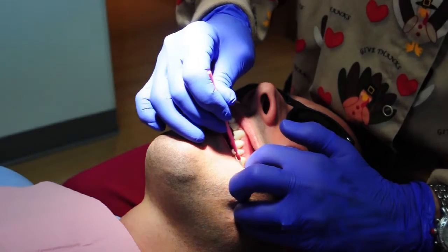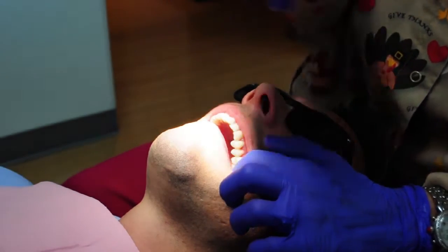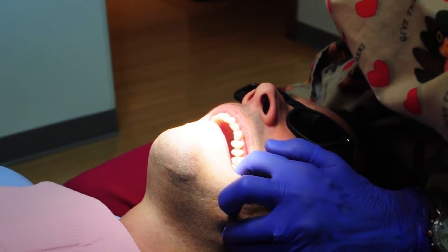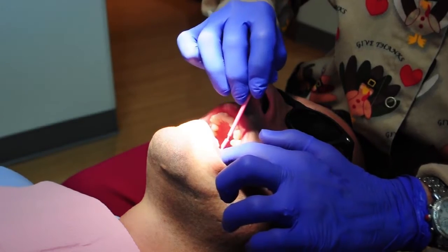If you see white streaks, you've over-applied. Repeat this step for the lower arch, back molar to the central with 1 swipe. Keep the cheek retracted for 3 seconds, or ask the patient to breathe through their teeth, quickening the set.